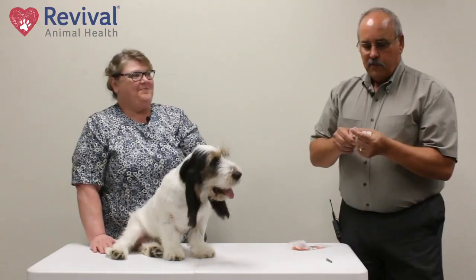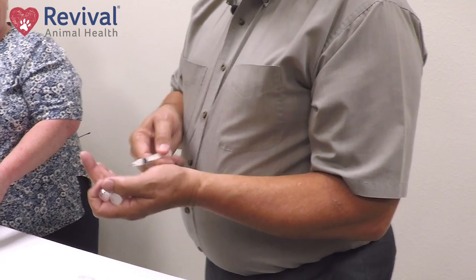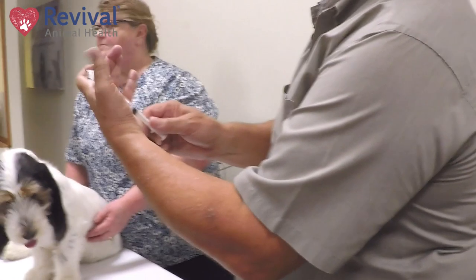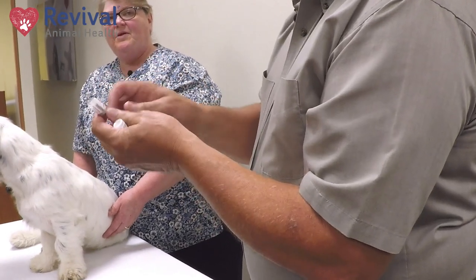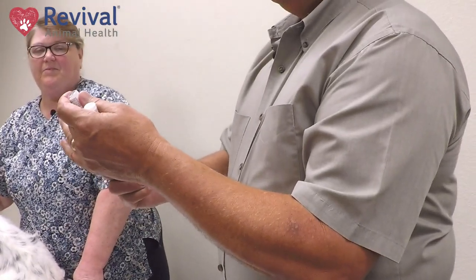When you mix these, make sure your needle is tight. All you do is pull up your liquid — it'll be in the vial that has nothing on it. Then you put it into the powder and inject it in there. Usually it'll suck it out of the syringe. I prefer not to shake it — I prefer just to invert it two or three times and it'll go into solution. Then pull it back up and that's what you've got. There's plenty of vaccine in this bottle, so if you lose a little bit it's not going to be a problem. There's plenty of virus to stimulate the immune system.